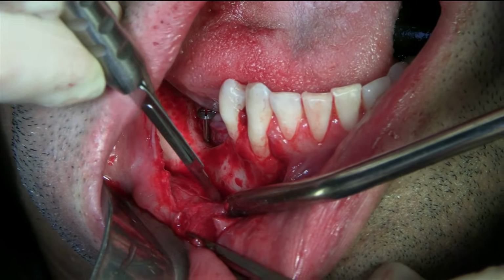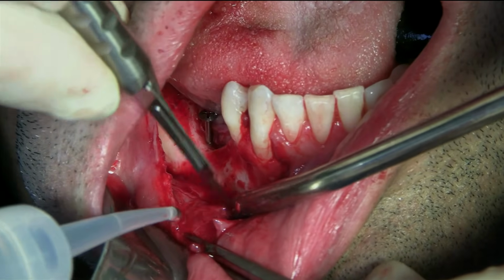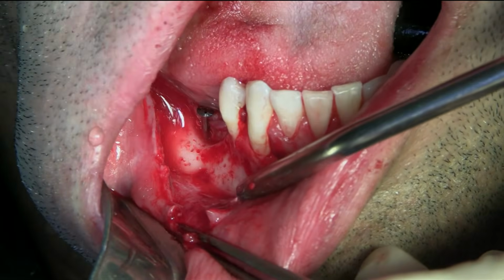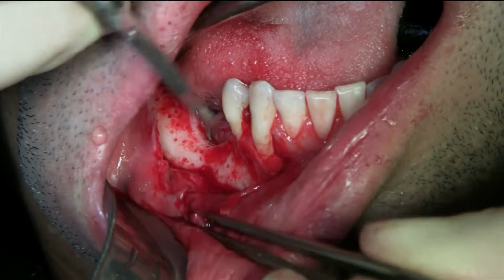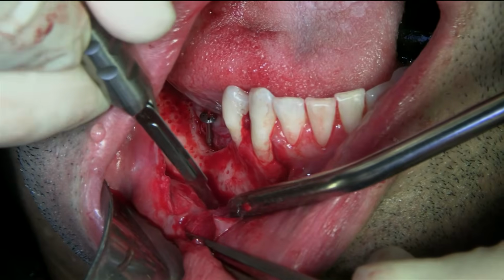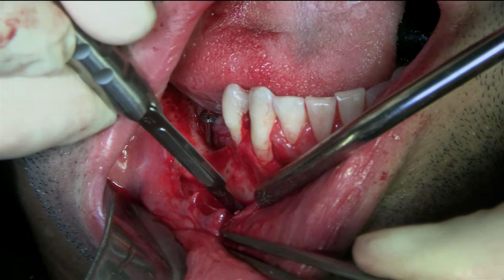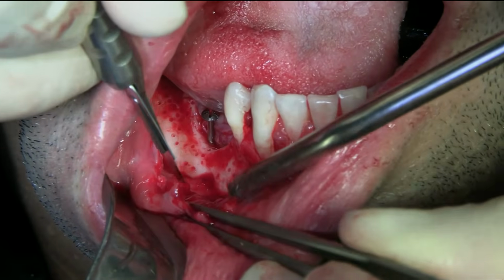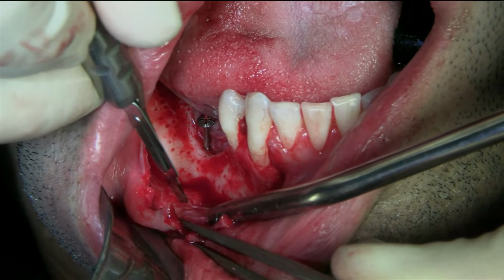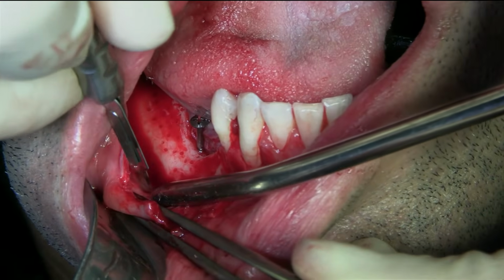You can give me water on the top, by the blade. Don't put the syringe there, just the water. Water is like this. You can see the opening right on top of the mental foramen, but I don't see any of the nerve fibers, so we're good.